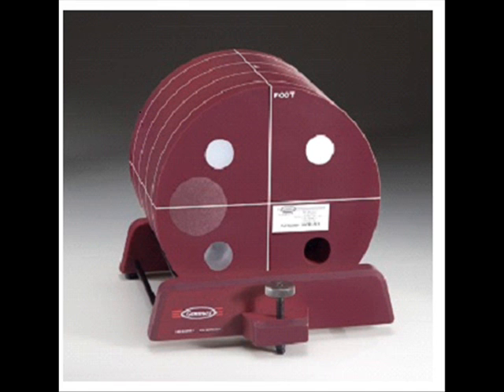The tool is a solid phantom made of GAMEX's proprietary solid water material. There are four modules. Each one is 4 cm in depth and 20 cm in diameter.